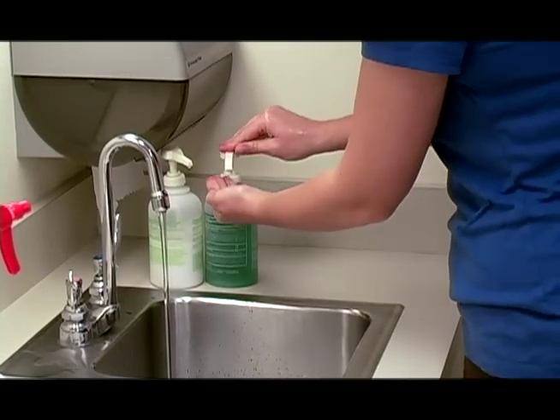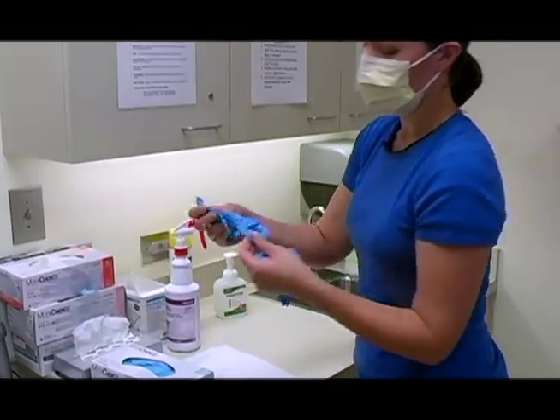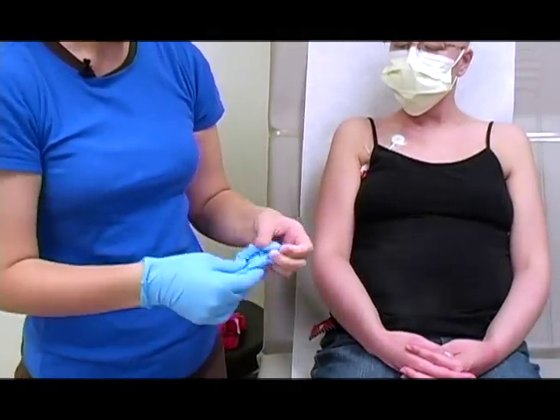Once your workstation is clean and ready, wash your hands once more. At this point, you may choose to put on a pair of gloves and a mask, but it's not required unless instructed by your healthcare team.